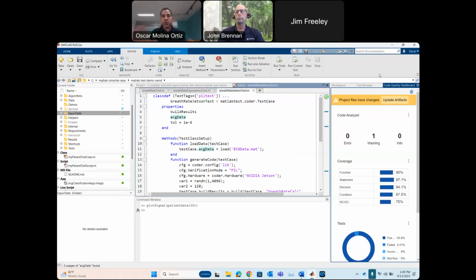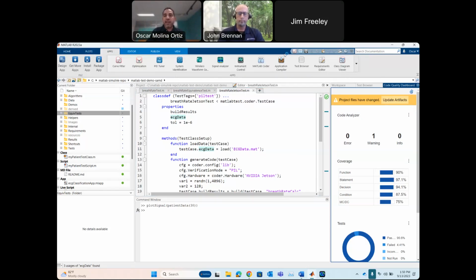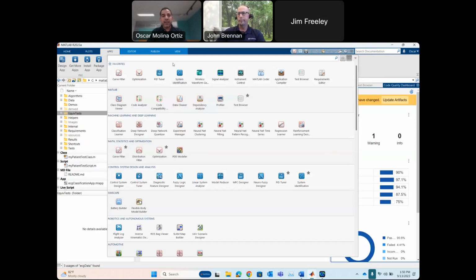And the second thing, just to close perhaps the demo part of it, is what John also mentioned about the certification kits, right? So we do have the IEC or the cert kit. That's what we call it. Let me just show it to you right here.